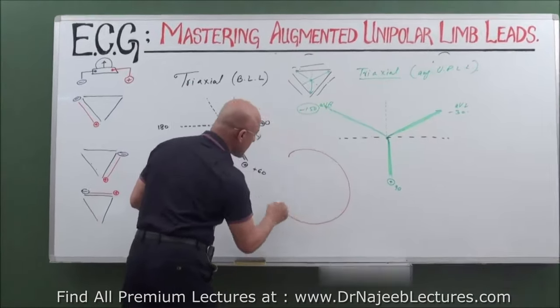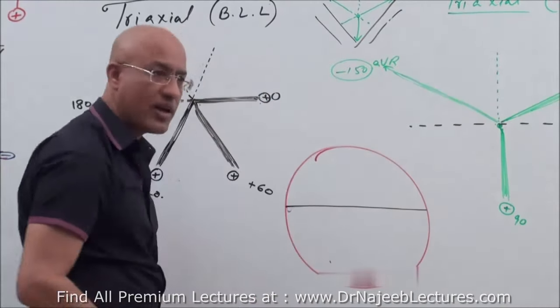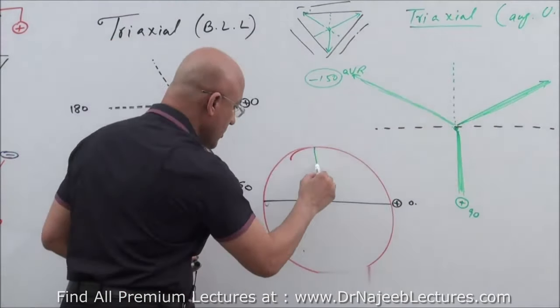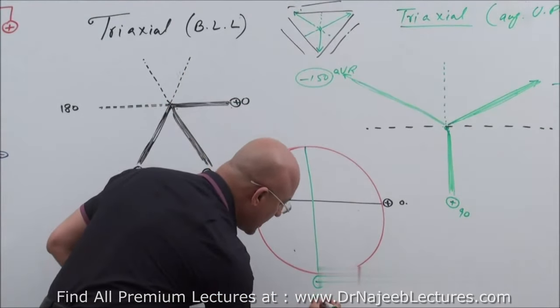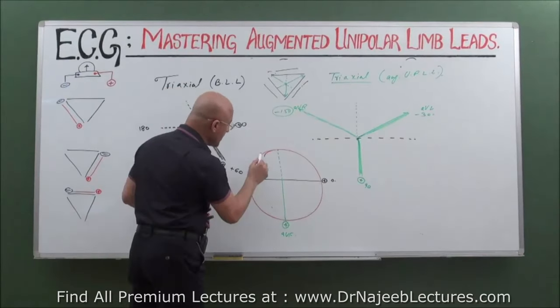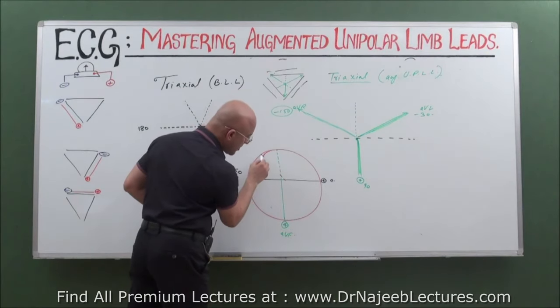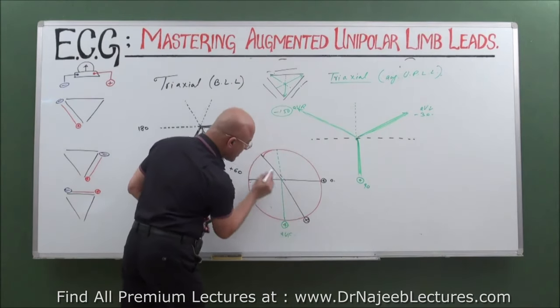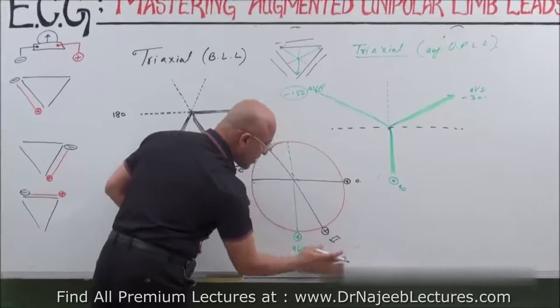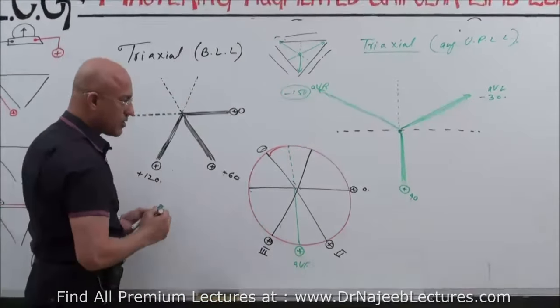I will make a circle here. Right? There should be one straight line, and make it a reference for the bipolar lead. What is this? Lead number 1, 0 degree. And if you make it straight like that, what is this? AVF. What is this? 90 degree. Now you will tell me, what is this? Lead number 2. Yes, you are right. And what is this? Bipolar limb lead 3. Is that right?